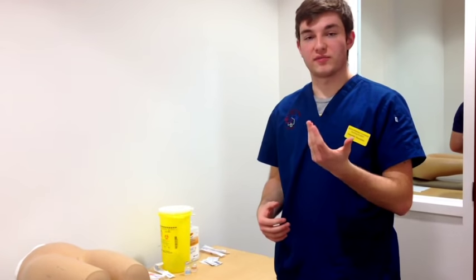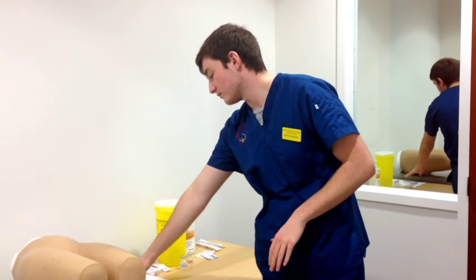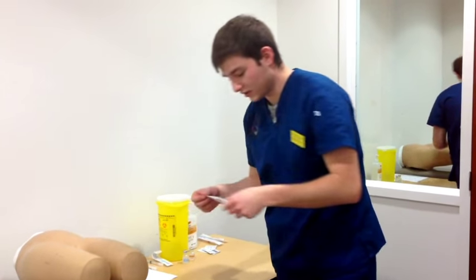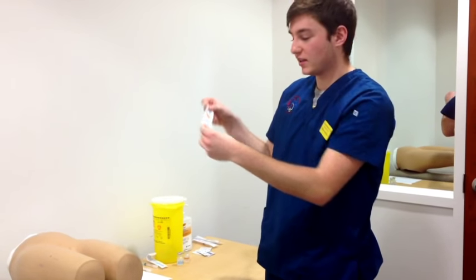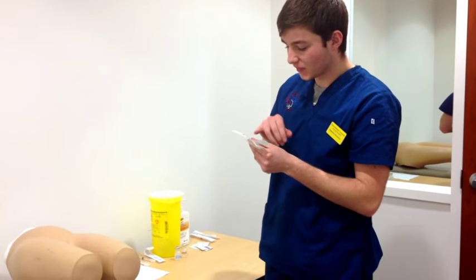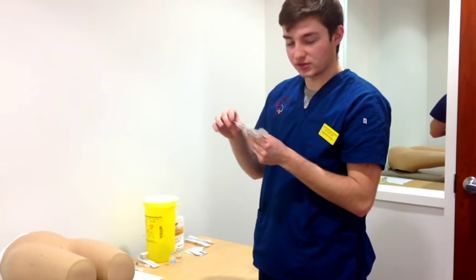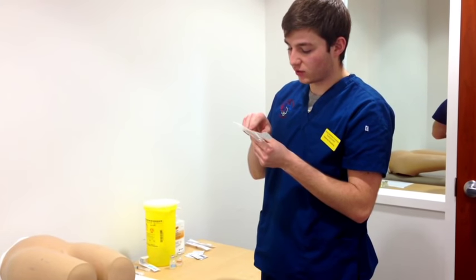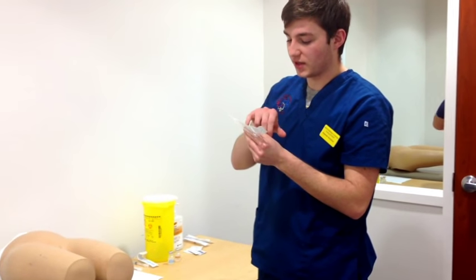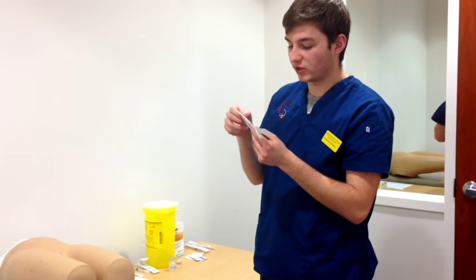Next, you want to make sure that we grab the appropriate needle for the injections. For heparin, we have a subcutaneous, and for Haldol, an intramuscular. For the subcutaneous, the syringe will come in a packet like this, and we're going to make sure it's the appropriate size and gauge for the client, based on weight, height, and other measures. We're looking at 25 gauge, which falls in the appropriate range for subcutaneous, with a diameter of 0.5 and 16 millimeters in length.